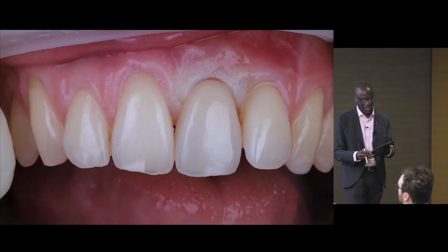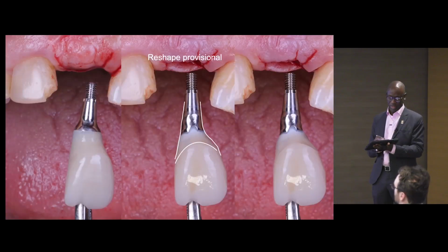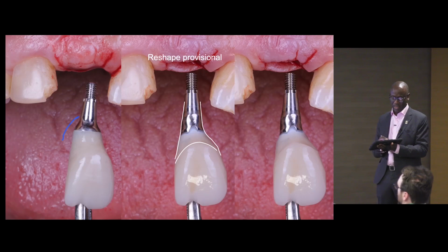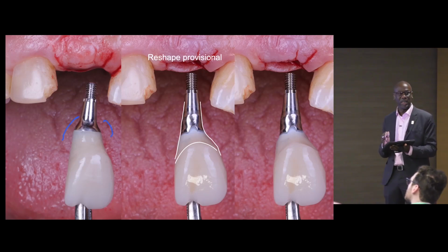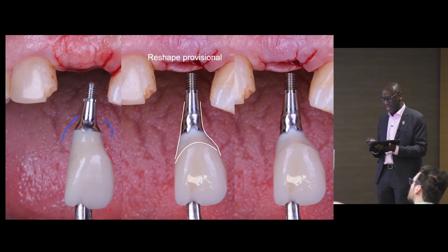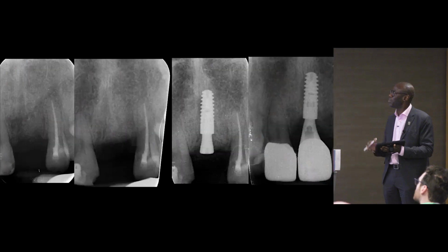Again, one more example of this. Here I've said to the lab, give me a tall tie base. They've given me a tall tie base, but can you see how it's slightly wider around there? You've seen how I've had to customize it, and I've had to do that chair side to this sort of shape.